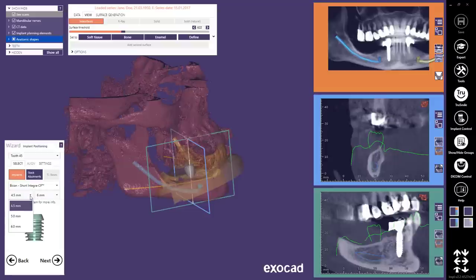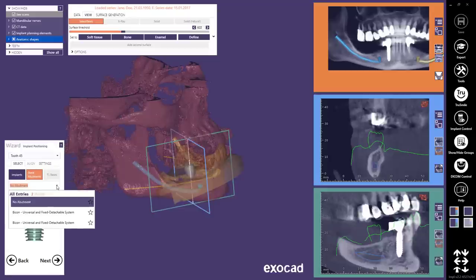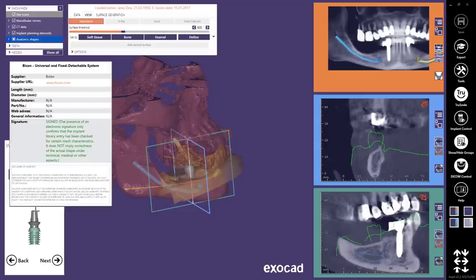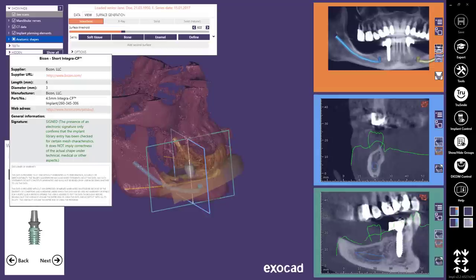After you have selected an implant library, you select one of its available diameters and lengths. For the selected implant library, compatible stock abutments are also available. However, the selection of an abutment depends also on the defined implant type. Similar to the implant library, you can choose between different available diameters, angles, and heights of the selected abutment library. The implant preview window shows your selections. Hovering over each implant part displays a pop-up window with information.